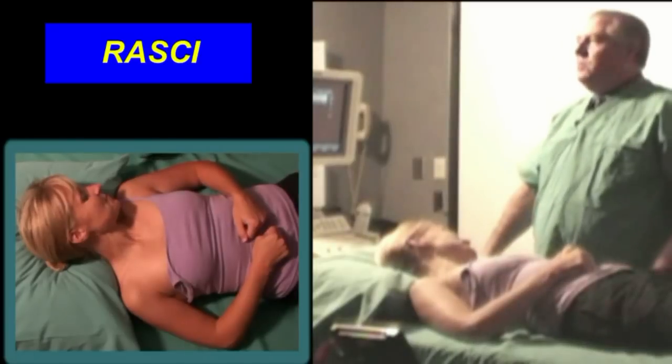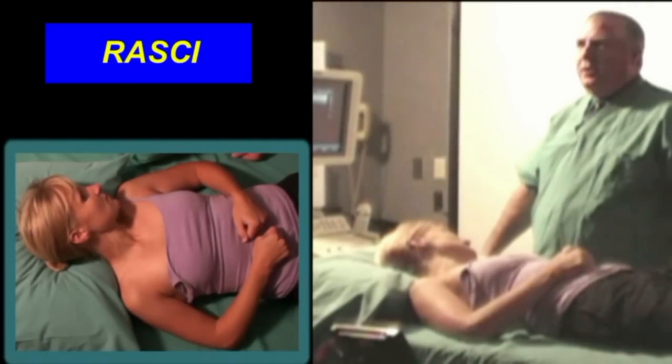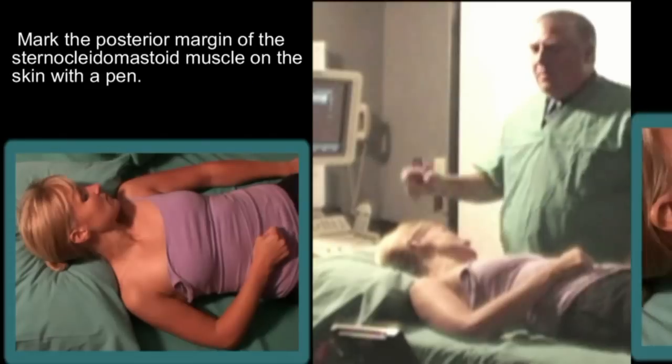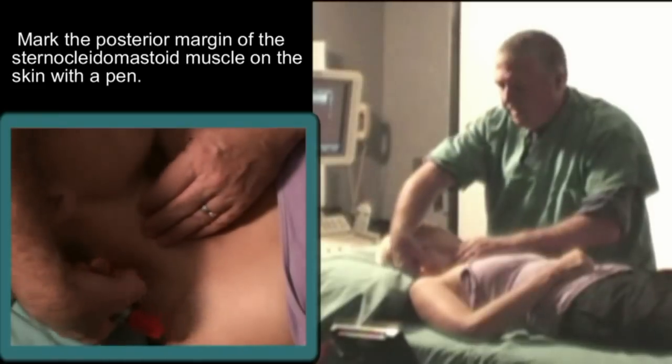We don't do many nerve blocks without ultrasound anymore, and I only teach it to people who are going to move to circumstances where they won't work with ultrasound. You can have the patient lie supine on the back, head turned away from you. Identify the posterior margin of the sternocleidomastoid muscle.